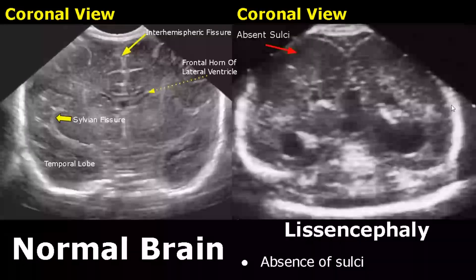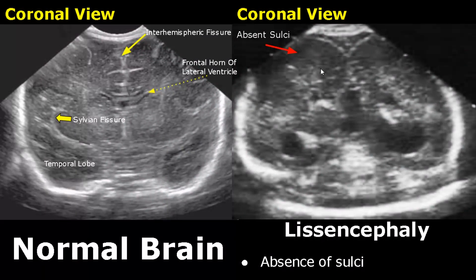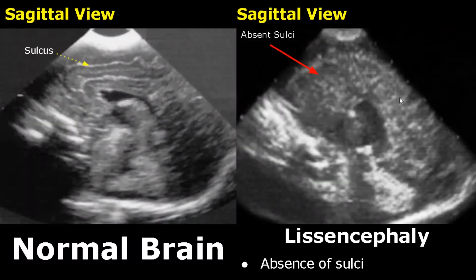Lissencephaly is a condition in which there is absence of brain sulci — it is also called smooth brain. In this sagittal view of lissencephaly, we do not see the normal brain sulci like we see in the normal image.